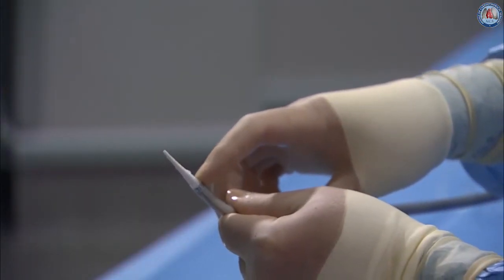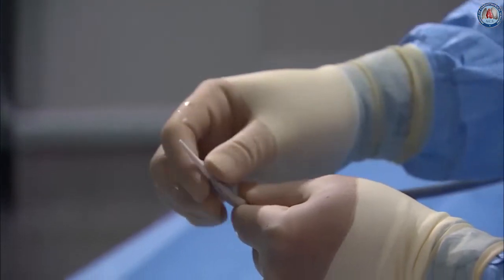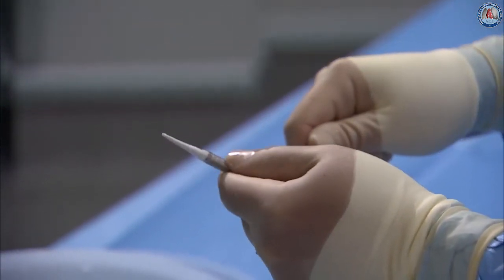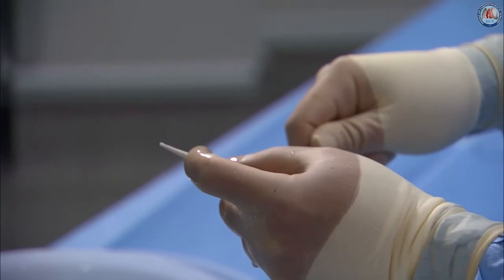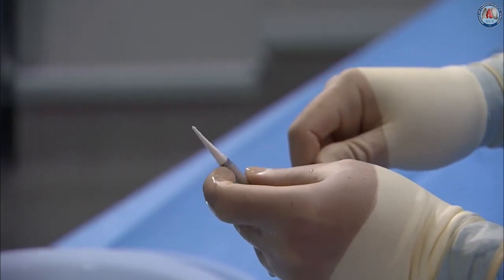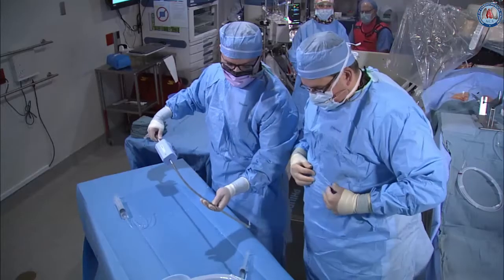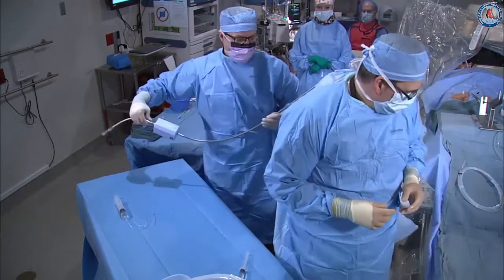At the end of the dilator there are stripes that are visible on echo. You want to make sure the transition between the tip of the guide and the dilator is smooth at that location. Otherwise, the guide is completely prepped. This time using the new G4 system, we're going to put the guide on the back table and then proceed with the preparation of our clip.